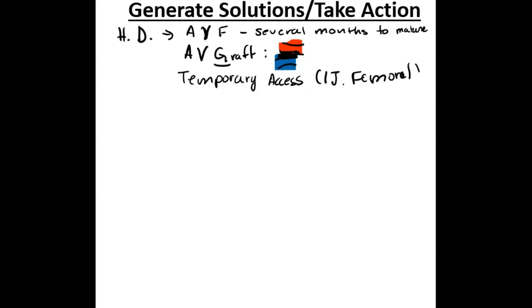Femoral is in a straight up emergency. We don't like to use femoral lines a lot for pretty much anything unless we really need to because of the risk for infection. Look what's nearby, the toilet.